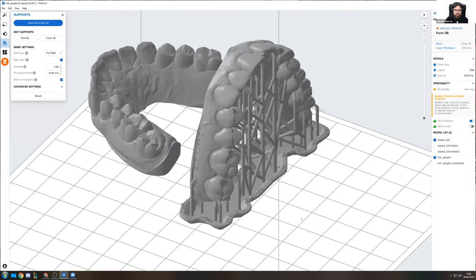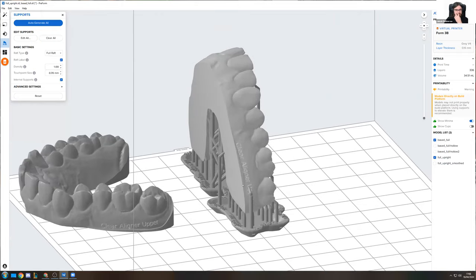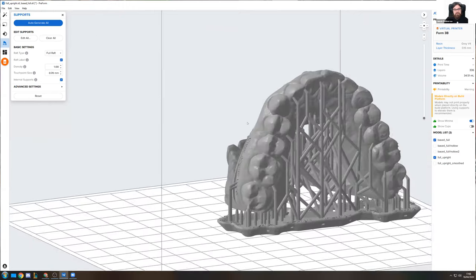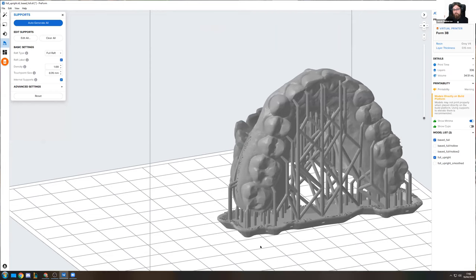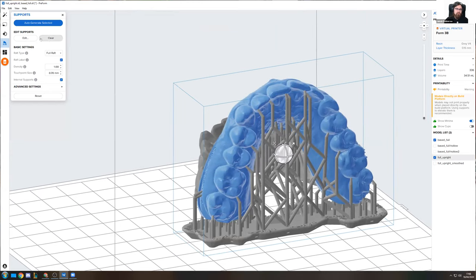As you can see right here, I actually did something that I didn't want to do. So I actually made a little mistake here. You can see that the minimas are solved right now due to the automatic function right here. But the problem is that the whole model is being propped onto supports, and you can also see that you actually have a couple supports on these teeth surfaces right here, which we generally do not want to have.